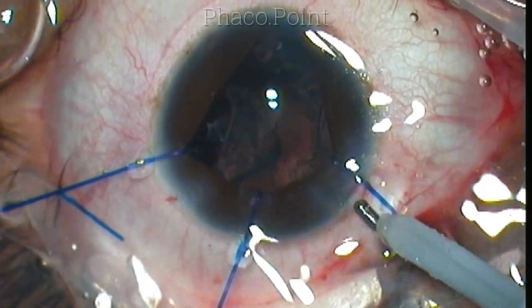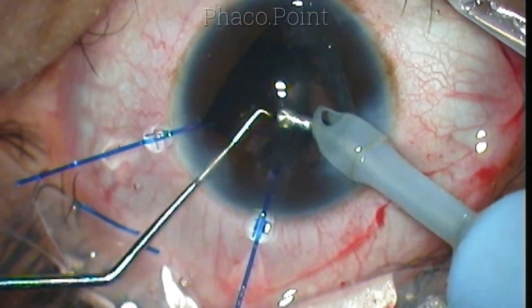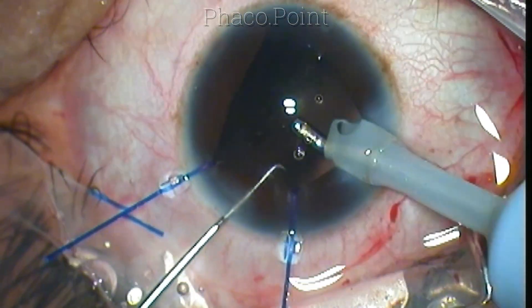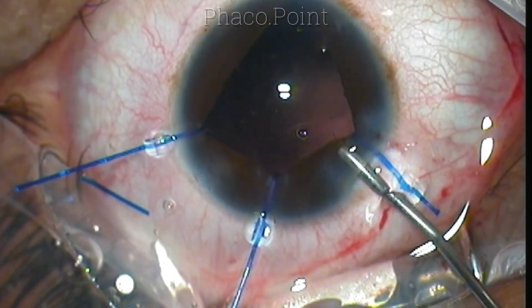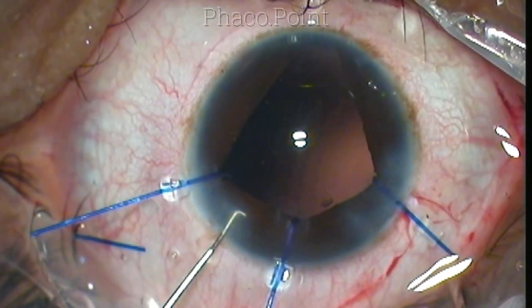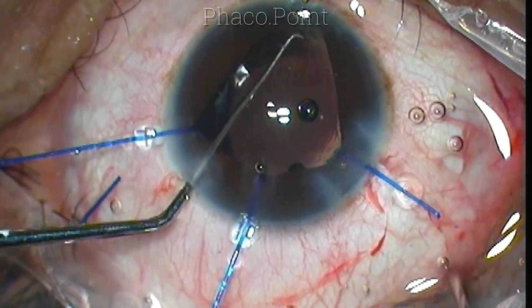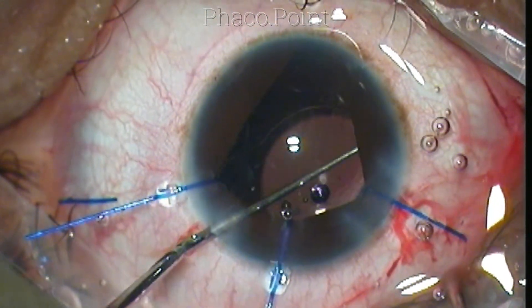The rest of the cortex is removed with simple irrigation and aspiration. The iris hook placed underneath the incision helps with instrument introduction, as the iris tends to get lifted up between the hooks. Once all cortex has been successfully removed and the bag is clean, I implant the hydrophobic acrylic lens within the capsular bag. The capsular bag is normally 10.5 mm in diameter, but it is much smaller in this patient whose corneal diameter is around 10 mm. The IOL length is about 12.5 mm, so the haptic tends to fold even within the capsular bag. With gentle rotation, I am able to settle the haptic within the capsular bag.